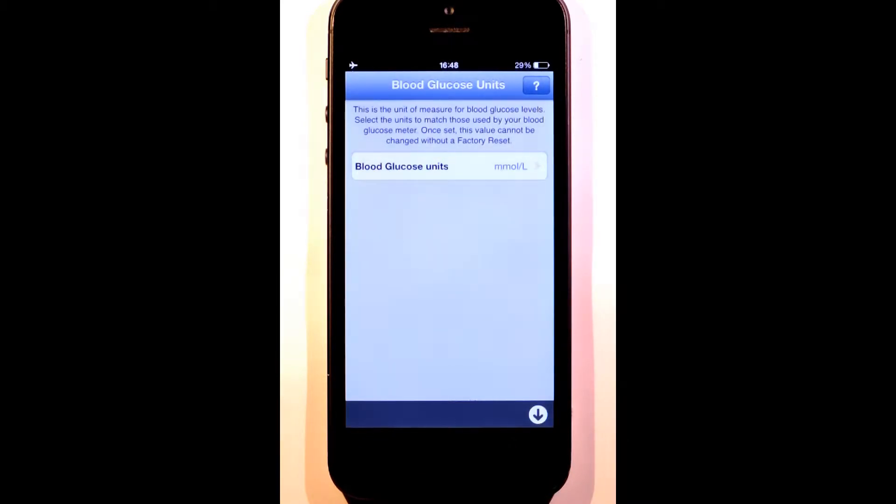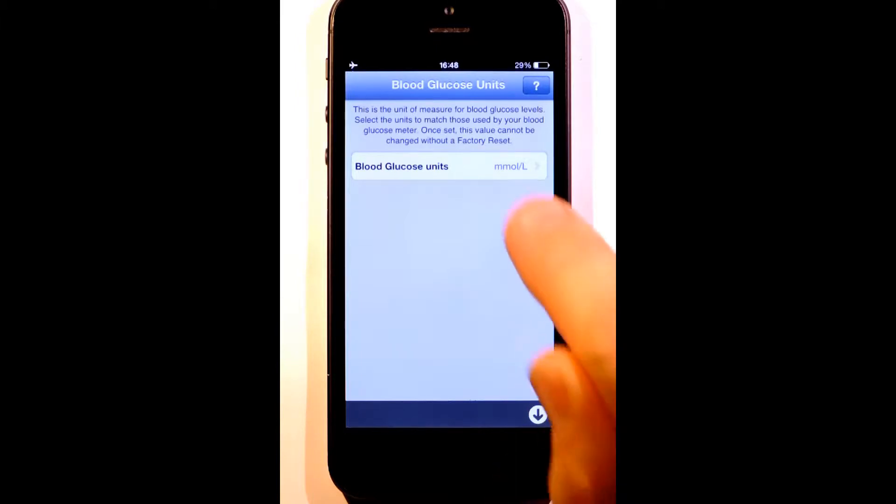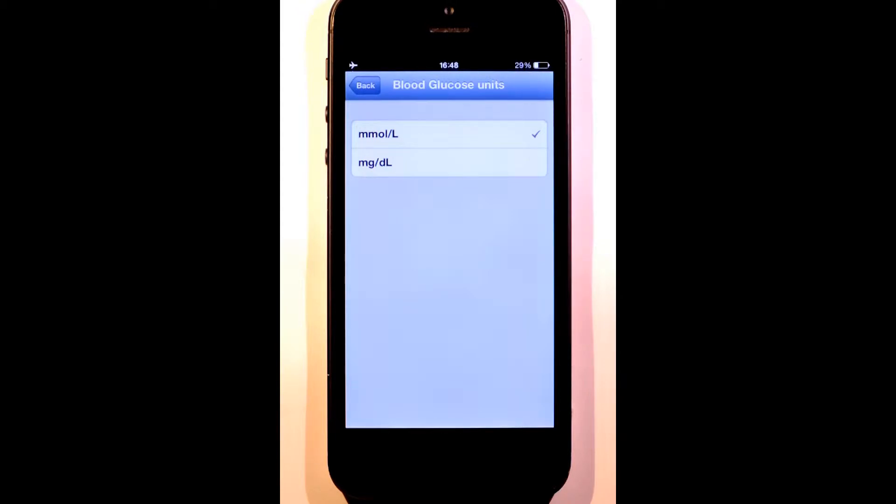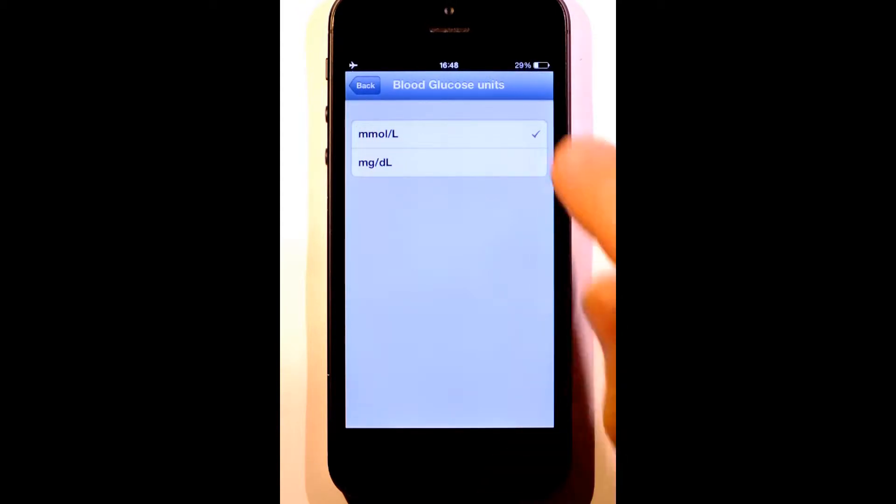Our first job is to set your blood glucose units to match your blood glucose meter. This is only done the first time you use RapidCalc. Since this is a key setting used throughout the app, if you ever need to change it, you'll have to do a factory reset of RapidCalc.